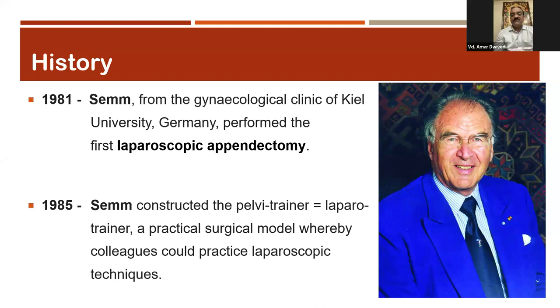So Sem established several standard procedures that were regularly performed, such as ovarian cyst enucleation, myomectomy in fibroid uterus, treatment of ectopic pregnancy, and finally laparoscopic assisted vaginal hysterectomy. He also developed a medical instrument company and designed many instruments during his career. And in 1985, he constructed a pelvic trainer called the Lapro Trainer, a practical surgical model where colleagues could practice the laparoscopic technique.